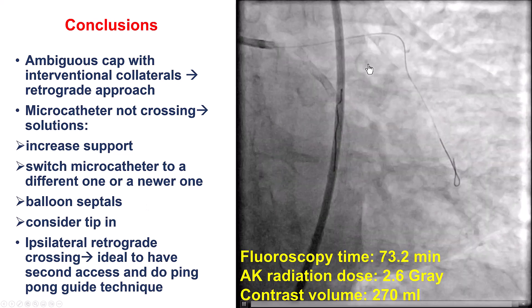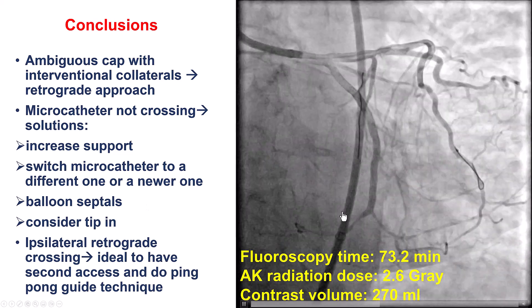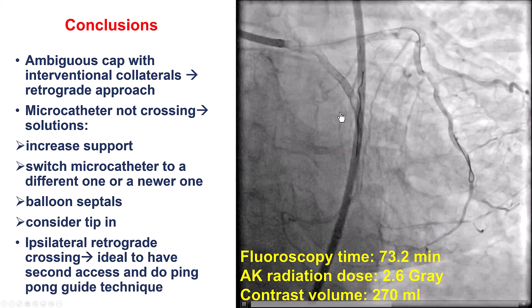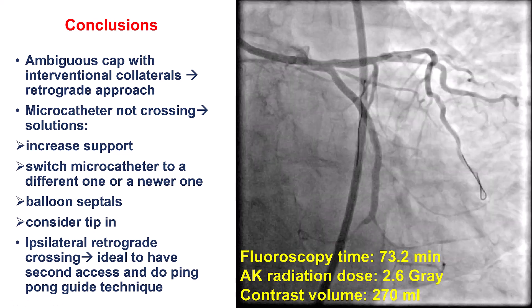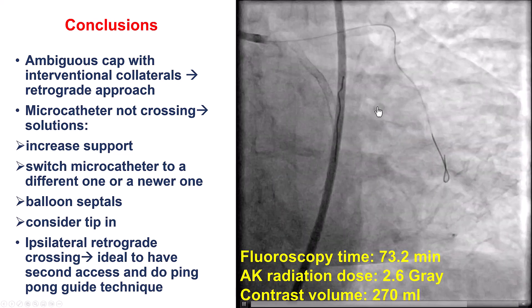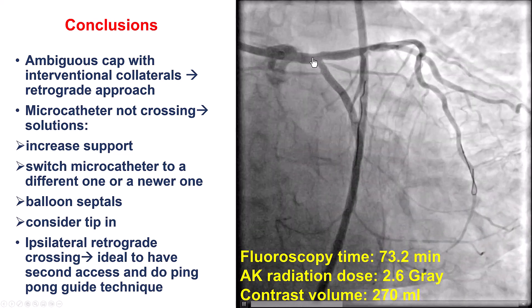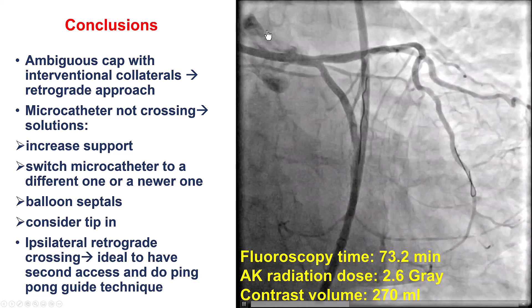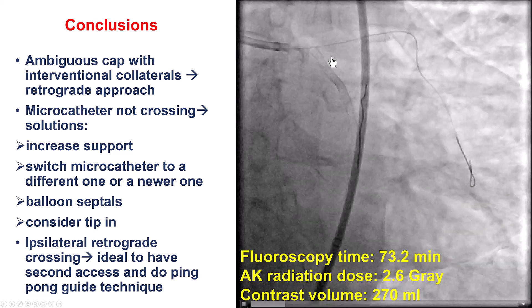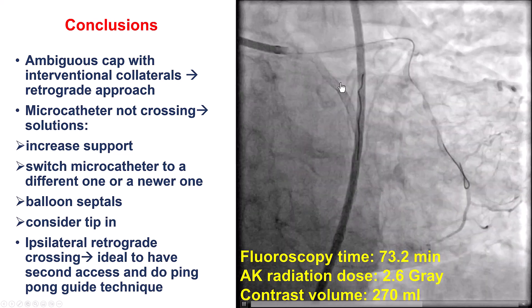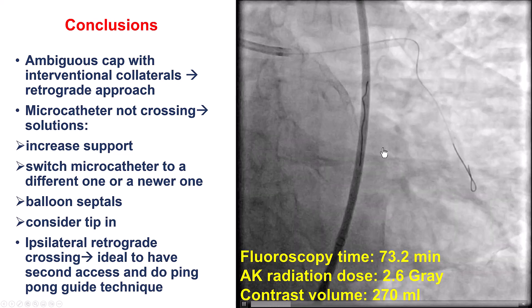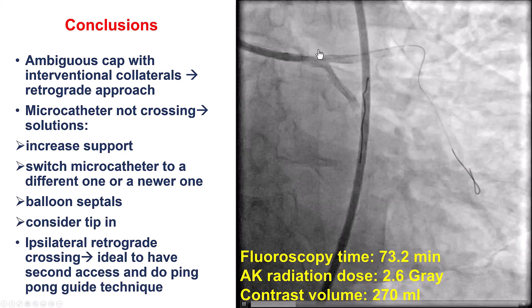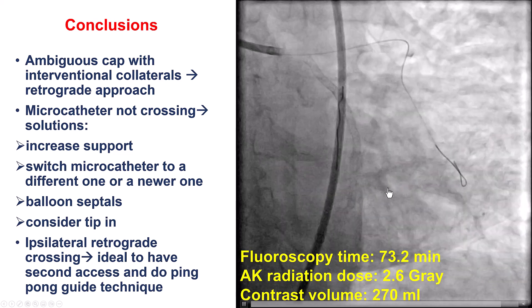In this particular case, we were eventually able to advance a new Caravelle microcatheter all the way to the distal cap and perform a reverse CART. The challenge after retrograde crossing was externalization, since everything was going through a single 8-French guide catheter. Nevertheless, we were able to externalize an R350, perform balloon angioplasty, and place a stent, achieving a nice final result.